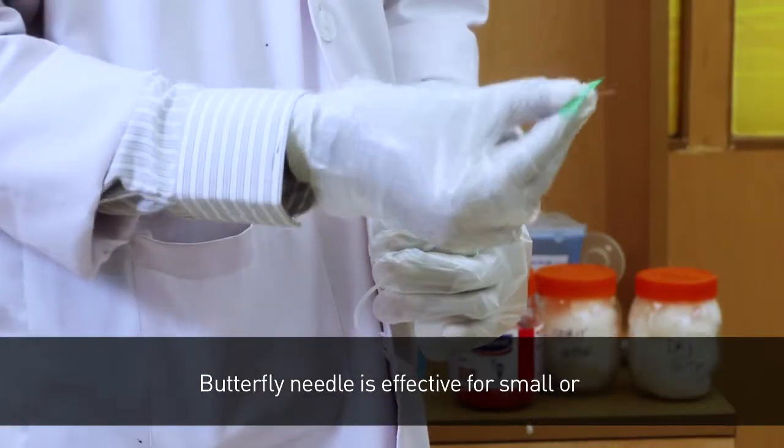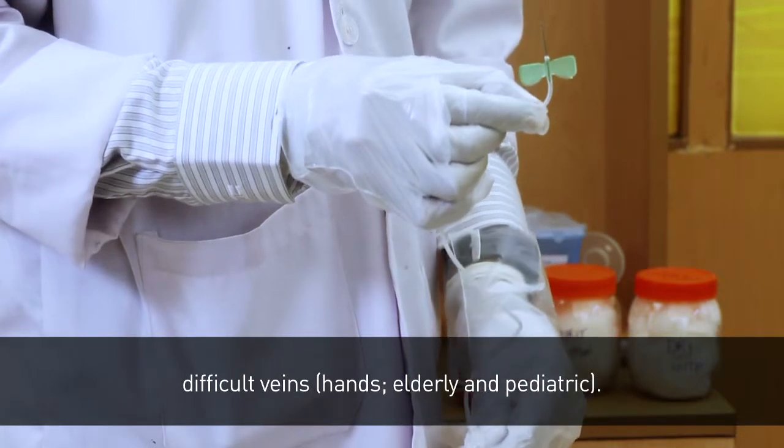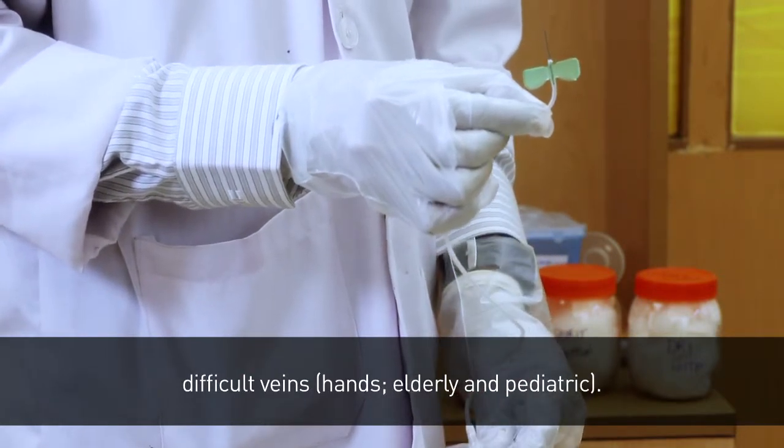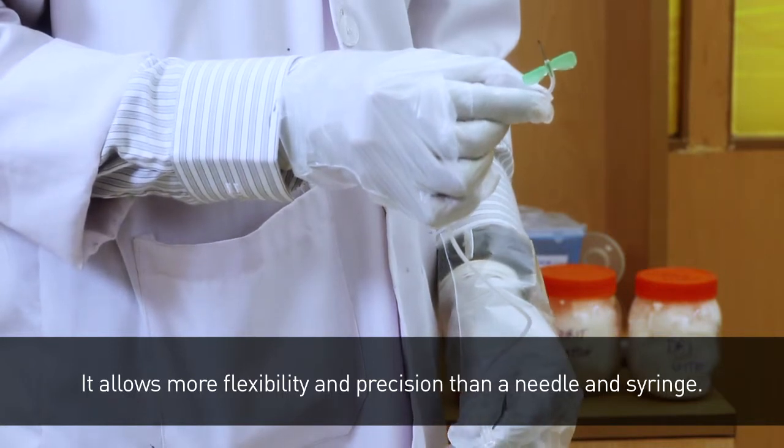The butterfly needle is effective for small and difficult veins, hands, elderly, and pediatric patients. It allows more flexibility and precision than a needle and syringe.